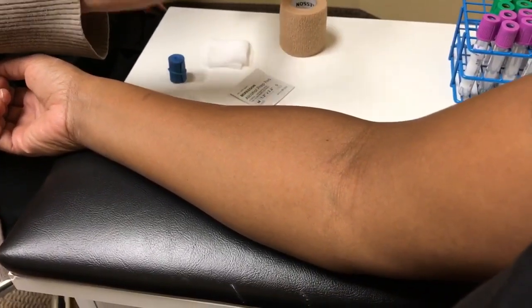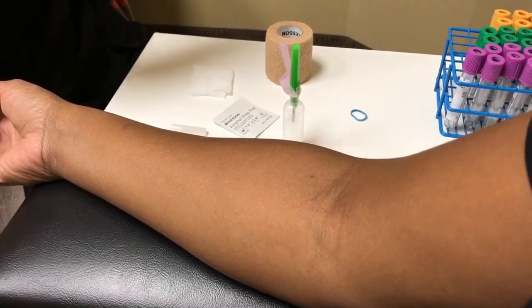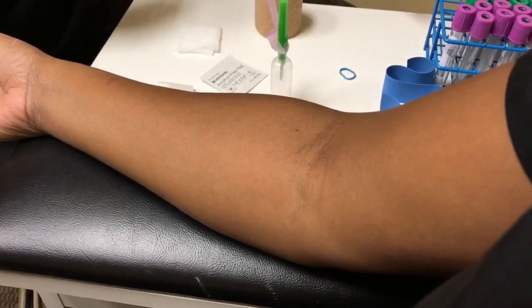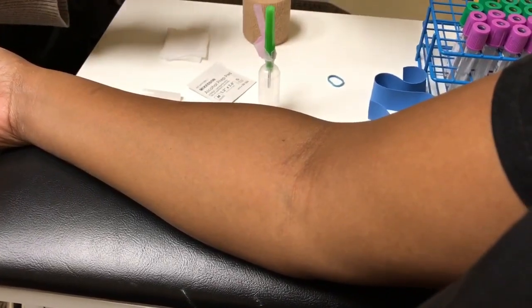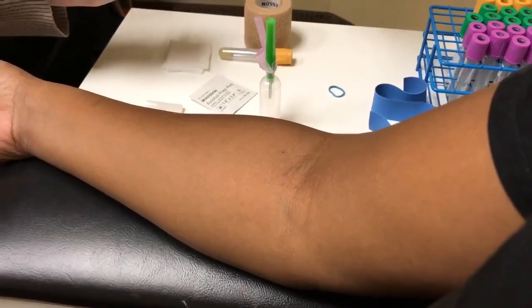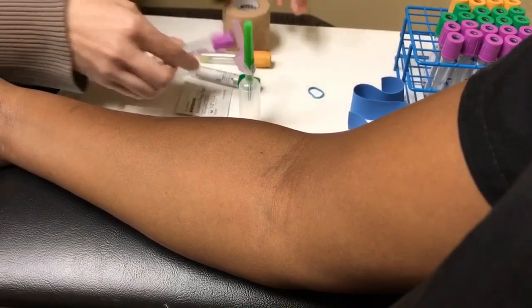The first thing I do is get the needle ready. Now that the needle's ready, I'm going to open my tourniquet. Today we're going to be collecting three tubes. We're going to go gold, green, and lavender. The gold tube is your serum separator tube, so this is going to go first. Your green tube is the sodium heparin tube, this is going to go second. And the lavender top is the EDTA, so this is going to go third.